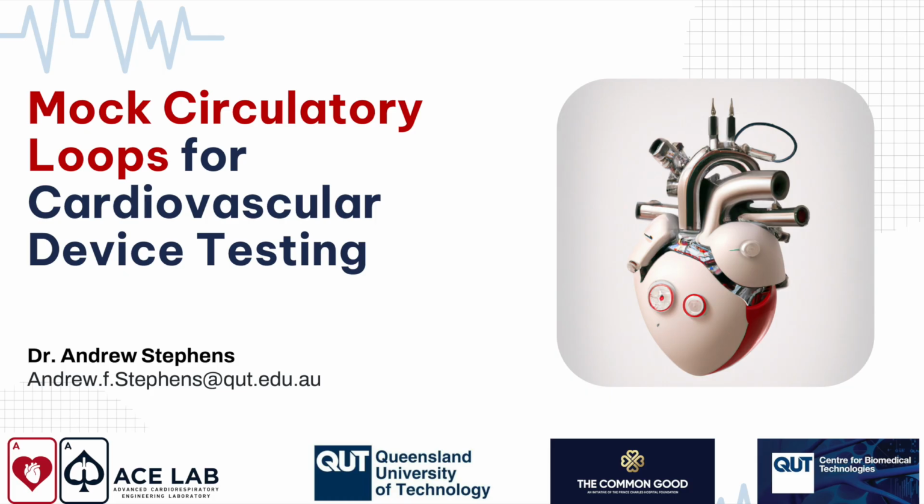There are all different kinds of valves. You can see here, this is an umbrella valve where the flow goes in and around the valve when it's open and snapped shut. There are these duckbill valves, which open and close like this. There are check valves, which have a tilting mechanism. There are mechanical bileaflet valves, so many different designs.